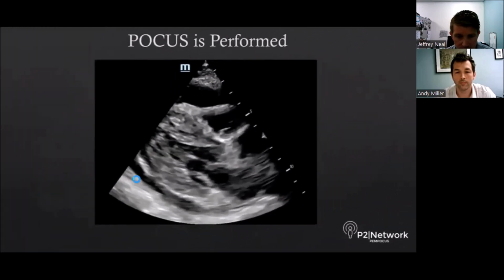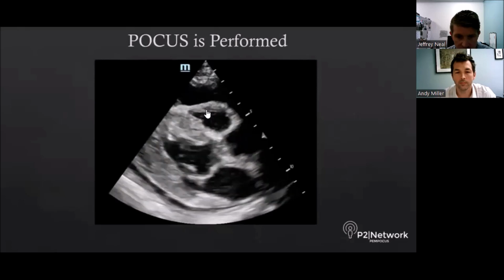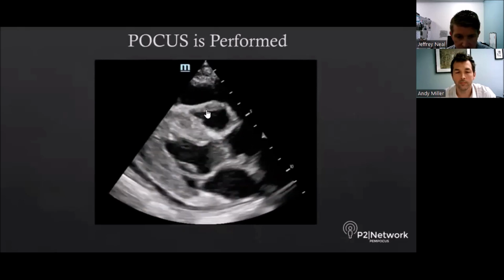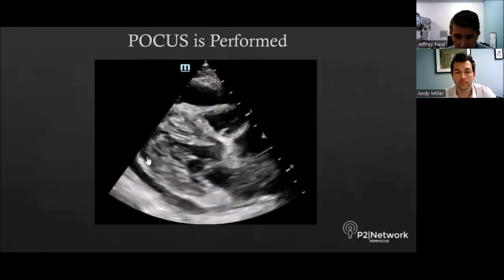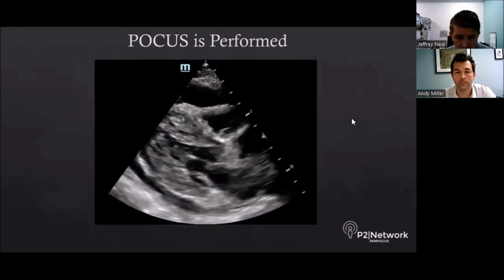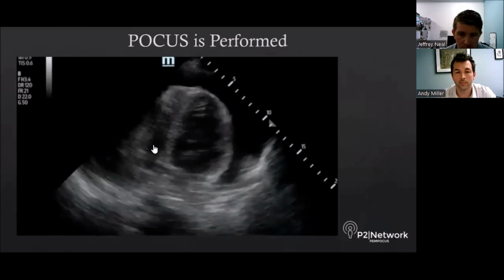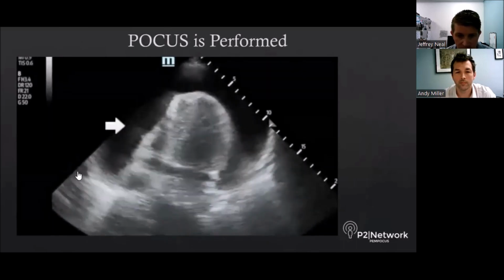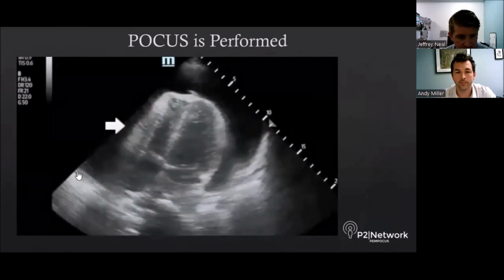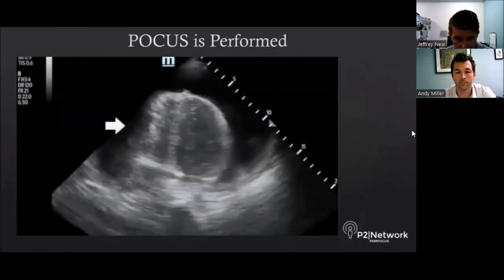This is another example of right ventricular free wall collapse as seen here. You can also, again, confirm collapse by utilizing M mode to plot the motion of both the mitral valve and the ventricular wall over time. Similarly, with our patient in the apical 4 view, you can see collapse of the right-sided structures during diastole, indicating a sonographic diagnosis of tamponade.